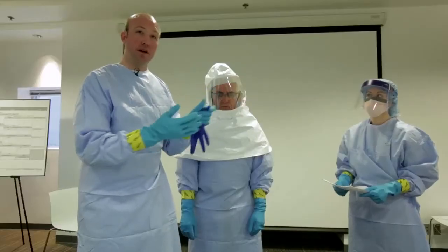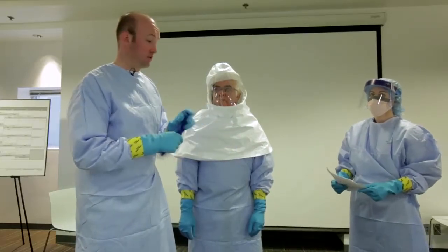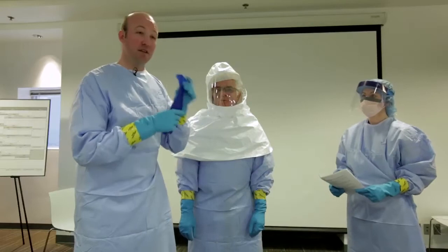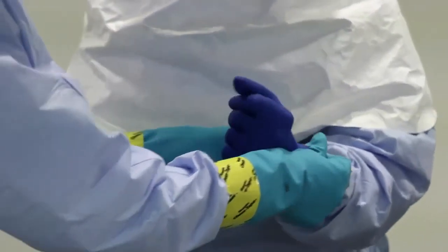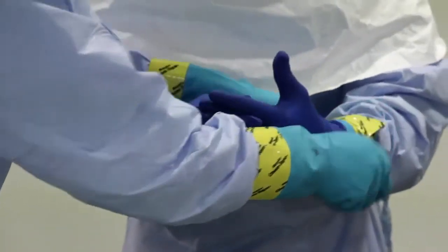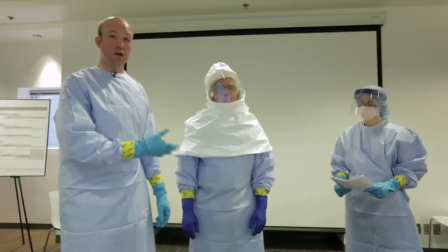We never want the care provider to expose their skin in the room, so we're putting two layers of gloves for his protection. This layer of gloves is actually for patient protection. What this allows is for the care provider to put on gloves if they're going to do something dirty, then take off those gloves and put on a new pair of clean gloves so they're not contaminating from within the patient room.